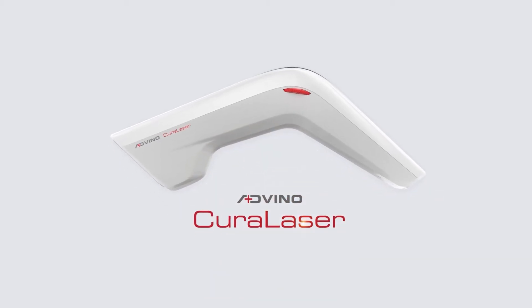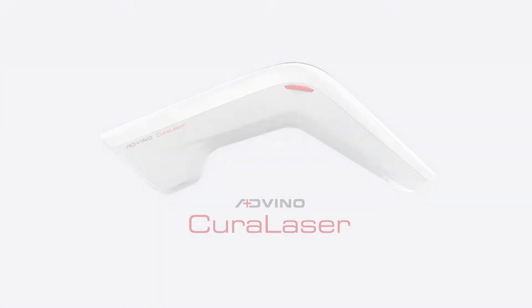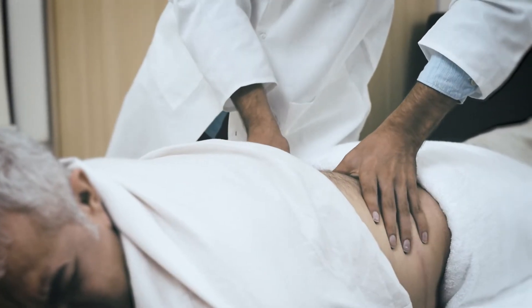This video demonstrates the use of Adveno Cura Laser in lower back pain. Assess the lower back for swelling, inflammation, and muscle spasm before starting the treatment. Identify the tender points.